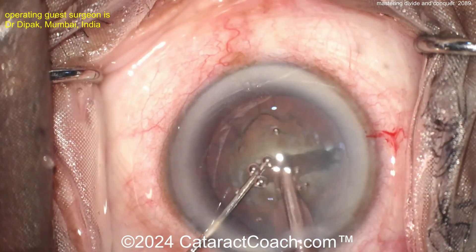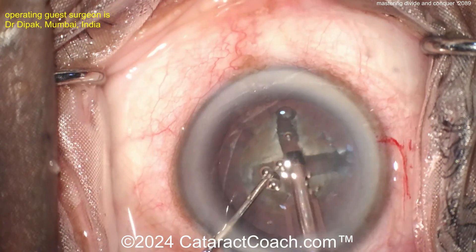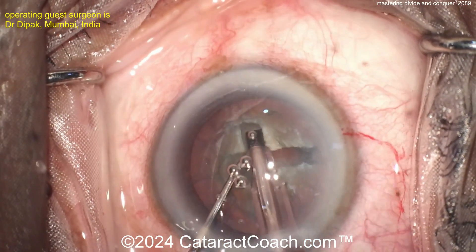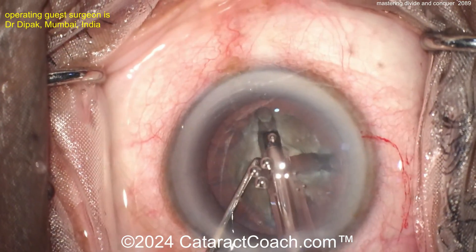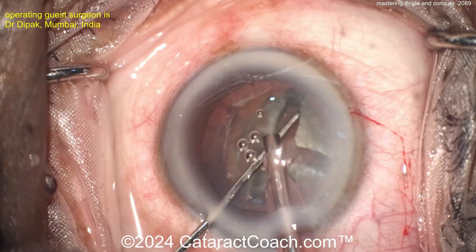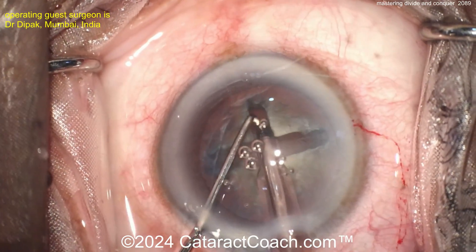Going inside the eye again with the chopper or Sinski hook, rotating 90 degrees. Now doing the second groove — divide and conquer: you're making a plus sign. You're going to make a total of two trenches that are the length or width of the nucleus, going all the way across. Rotate a little bit more to enlarge it. This plus shape means you're going to split the cataract into four quadrants — a four-quadrant divide and conquer — breaking up the cataract into four small pieces.